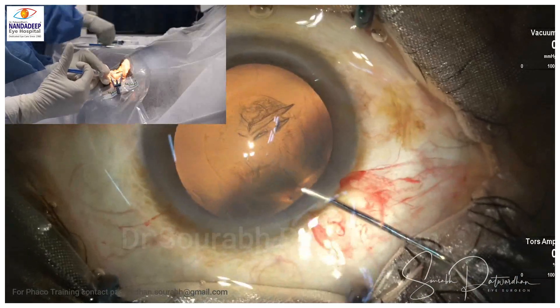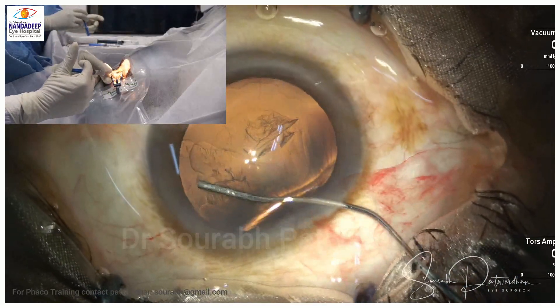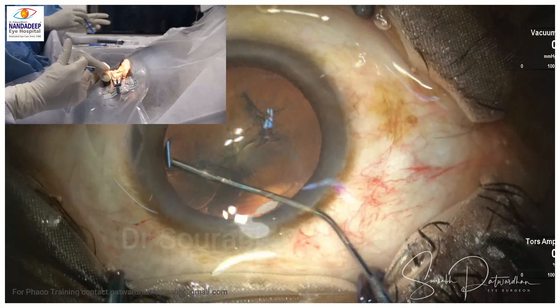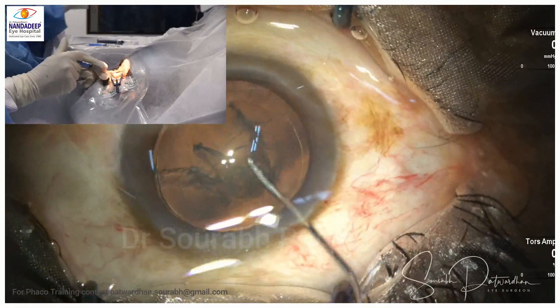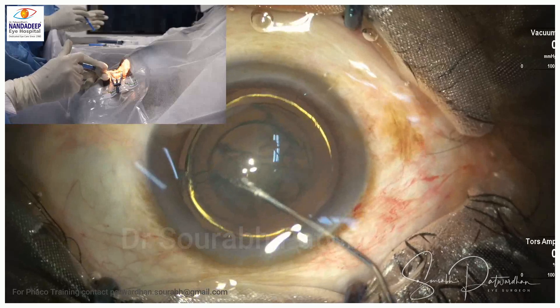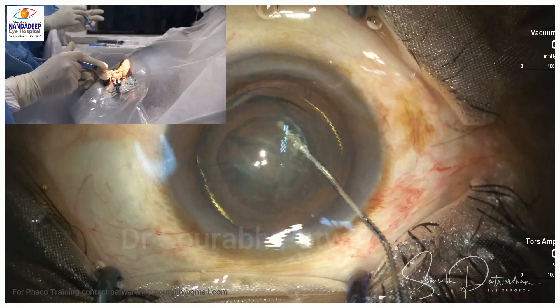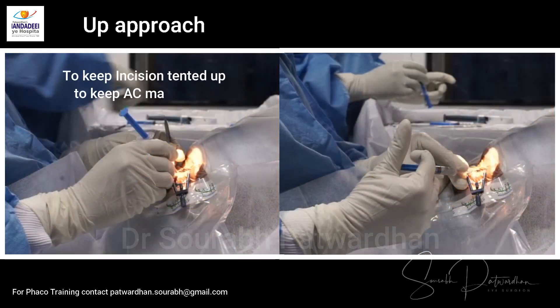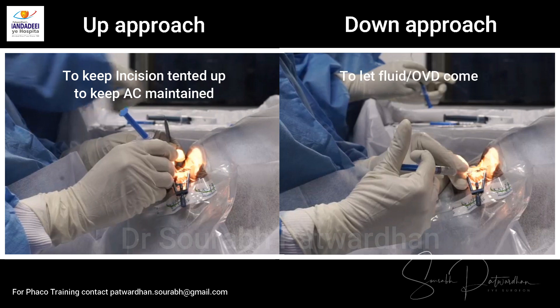Now when I am doing hydrodissection it is the other way around. My hands are at the plane or trying to go below the plane of the eye, because I want to depress the posterior lip of the incision so that fluid is not built up in the anterior chamber — I want to keep the anterior chamber pressure low. You can watch this difference between the two images: the hand approach is different in capsulorhexis versus hydrodissection.